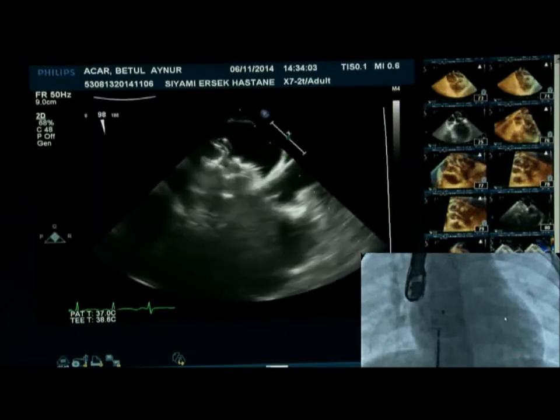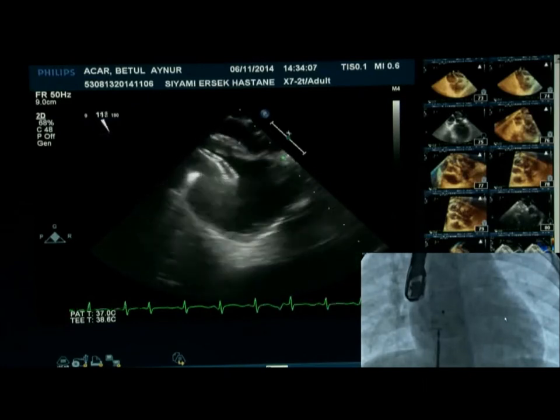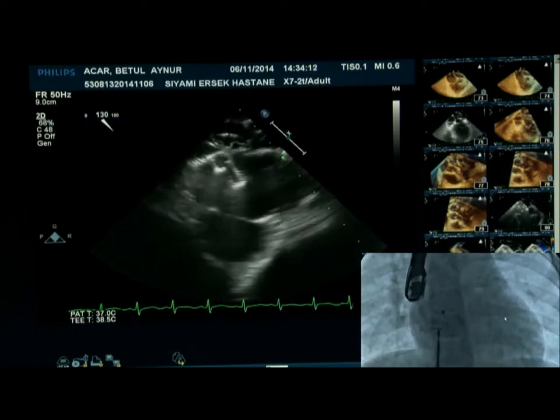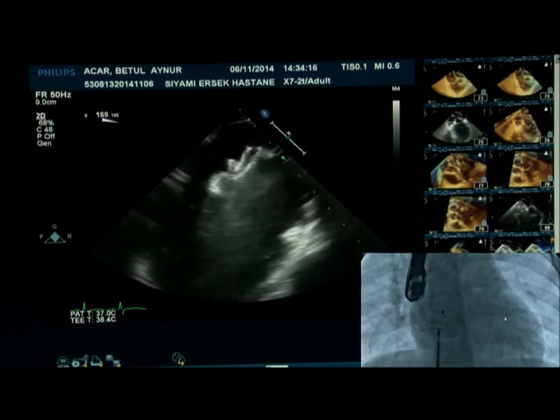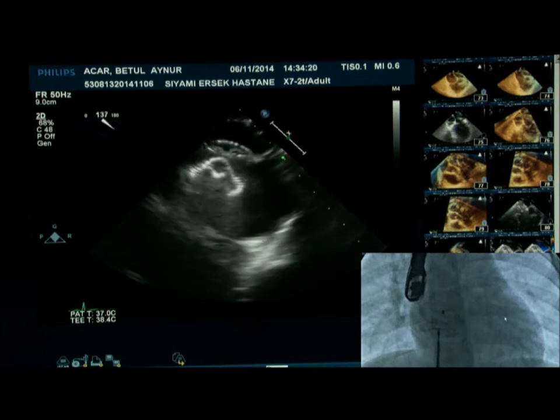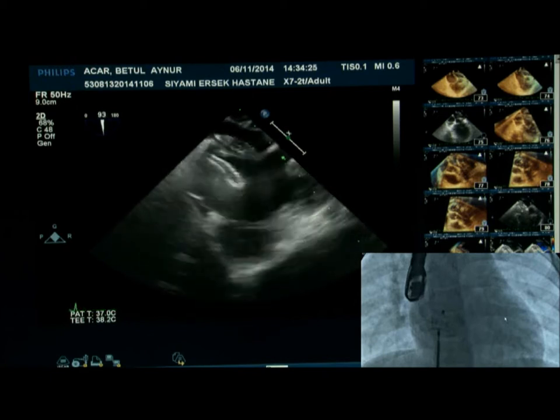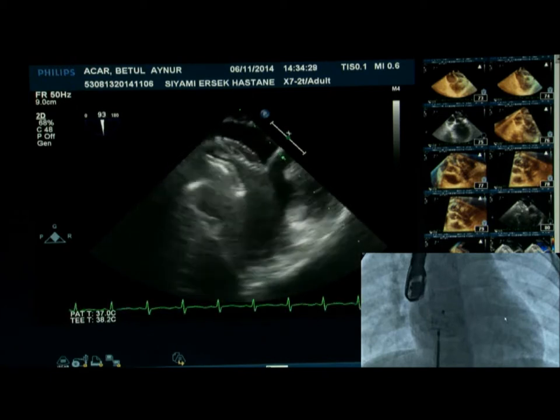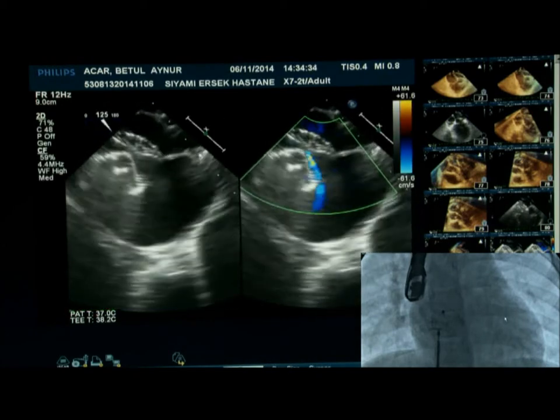Yeah, the thing about atrial septal aneurysms is that you probably need to get the positioning right at the first attempt, and that means you have to be through the correct defect, because if you have to keep retrieving the device, then you're likely to tear the atrial septum, and then either the device may not stick or you'll have to resize it, and so on. So that is one of the risks. So you have to get it right at the first attempt.